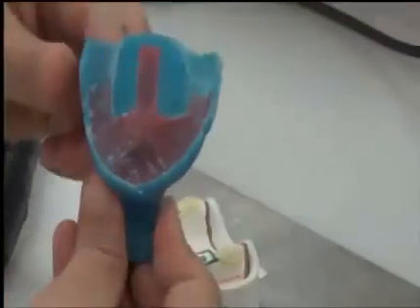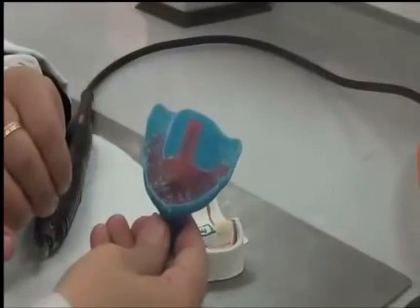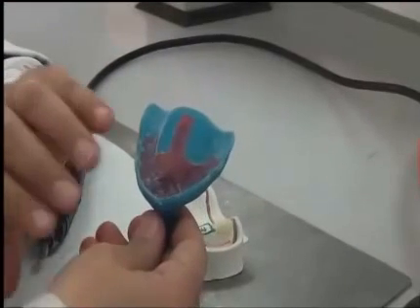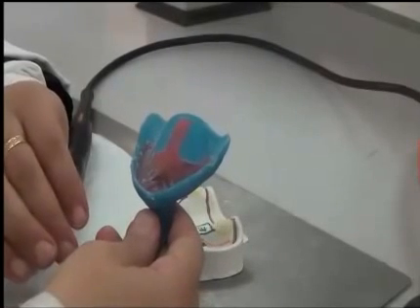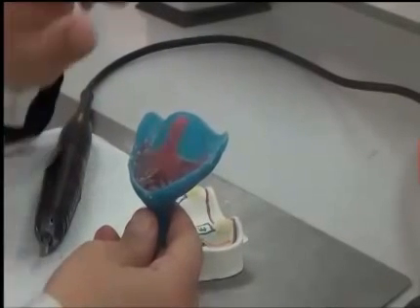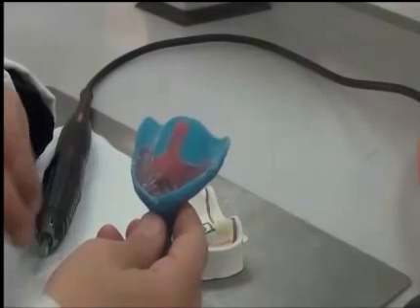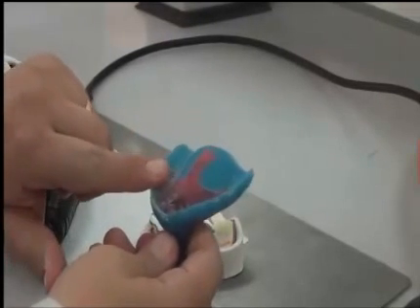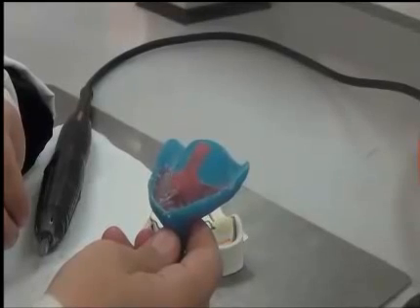It contains the partial relief embedded inside this tray. So this tray is ready. You're going to finish the upper tray only. For the lower tray, it's just for you to put in the holes before you cure, and you're going to train on that. But the submission will be on the upper tray. You're free now to go in and begin working with your tray.